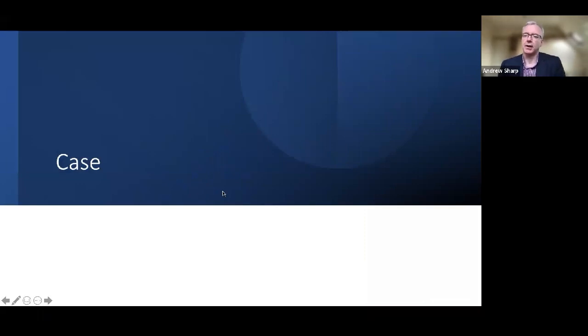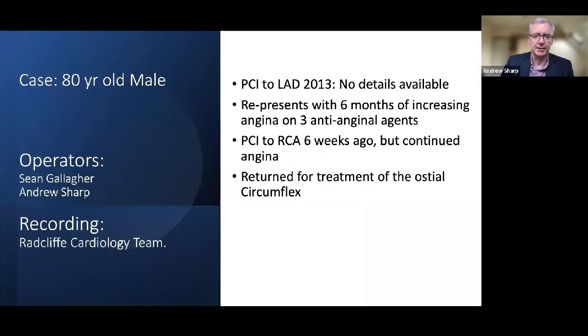Okay, so we're going to get into the case now. That's enough of the lecturing, and we're going to talk through a case that Sean and I did. So Sean, tell us about the case. Give us a bit of background.